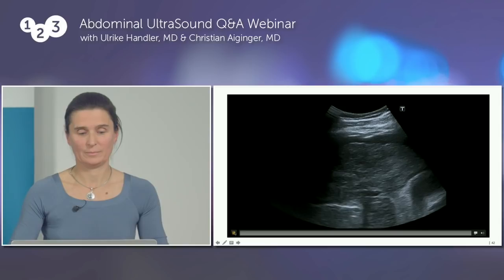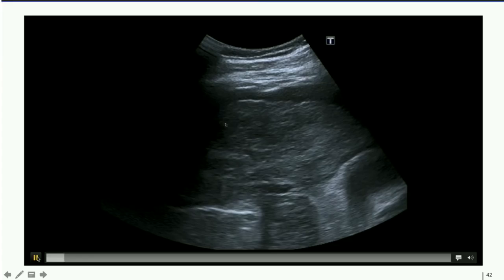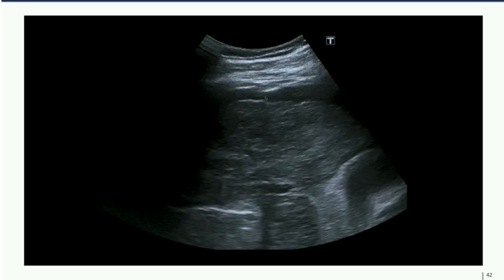Take a look at this picture: what would you think about the capsular contour of the liver — is it smooth? No, it's quite irregular, with small little humps everywhere. That's a feature of liver cirrhosis: an irregular liver contour. Also look at the liver parenchyma — the echogenicity is not homogeneous, the tissue is somehow irregular too.